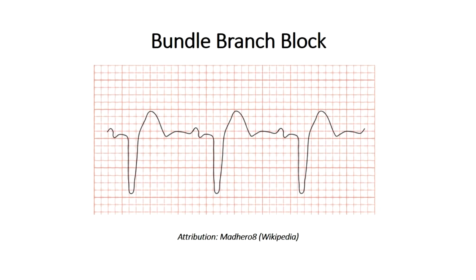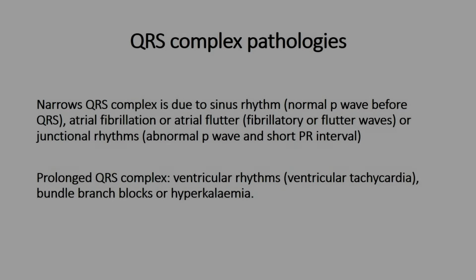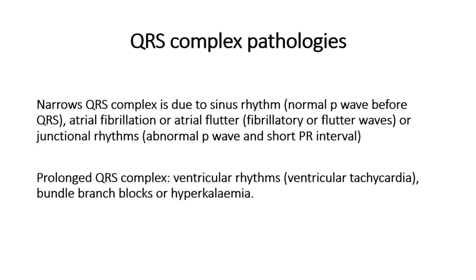So, in patients who have abnormally high potassium levels, such as hyperkalemia, widening of the QRS complex is something that's also seen in these patients. So that's really all you need to know about QRS complex duration. The final thing you might need to know about is in terms of the voltage of QRS complexes. So let's discuss the voltage now in the next section.